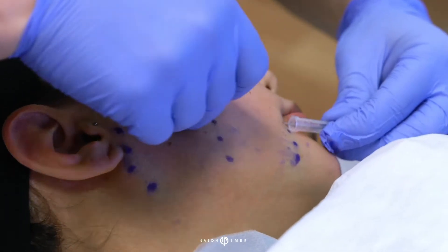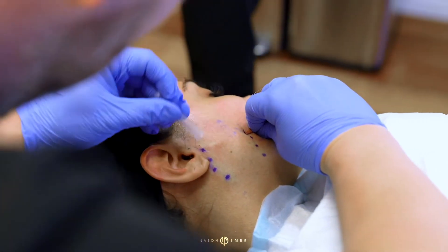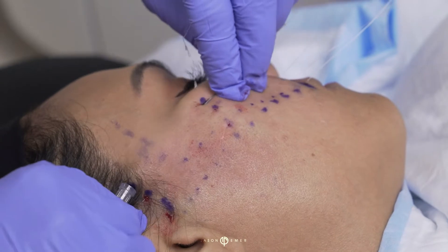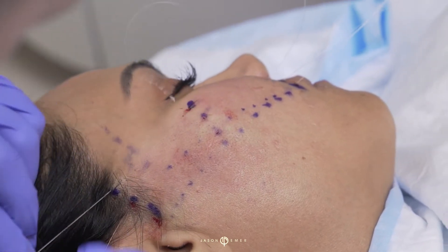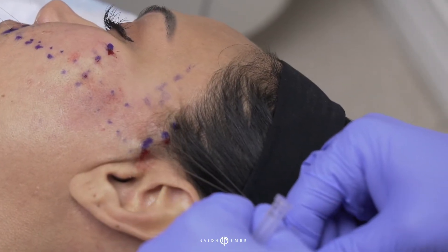What we're doing here is placing these threads to give her underlying support to help lift that area and over time build collagen. We're literally going under the surface and anchoring those sutures into the spots that we want to get her a nice lift.